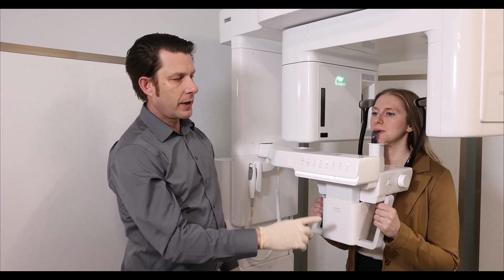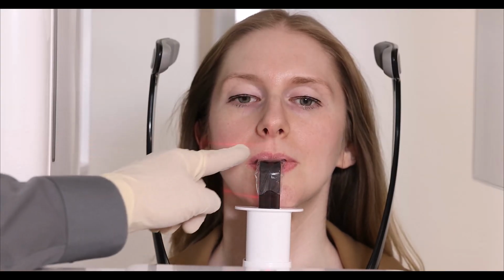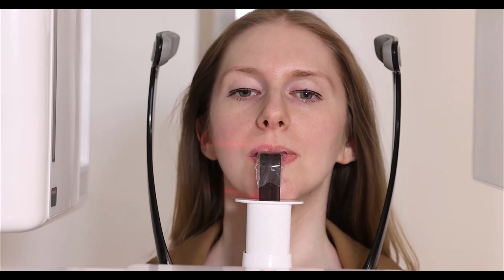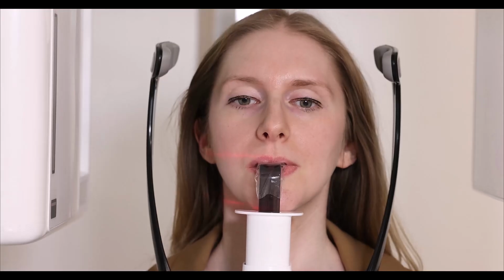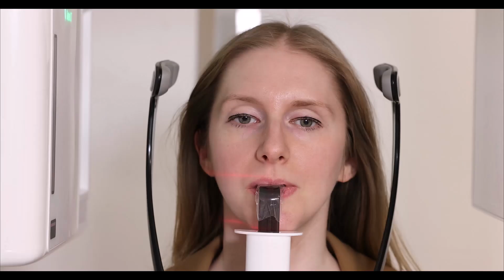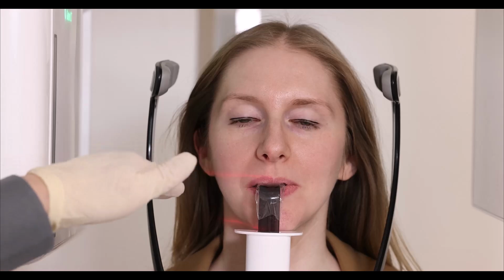To do that, we are going to choose our chin rest up or down. And in this case, I'm going to go ahead and raise the chin rest up, which raises the patient up. You'll see as we raise the patient, this line is almost right at the gum line. I'm going to raise this chin rest up a little bit more. And we see that the patient has raised up, so I want to lower the machine down by the column down, which is going to flatten out their occlusion. Ensure that the chin is still on the chin rest. Go ahead and smile really big for me. And I can see this horizontal line is right about the patient's CEJ or the gum line. The patient does have a flat occlusion.